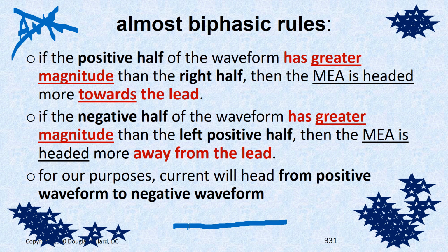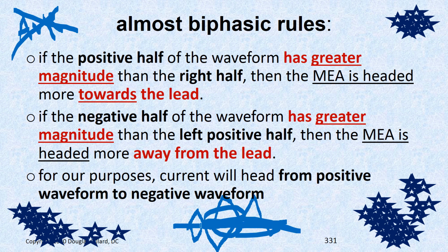Like you read left to right, we're going to always assume the current's flowing left to right for right now. Whether it be a little one or a great big one, it's always going to be to the left. AVR is reversed. It'll be down, and then the trailing wave will be up. But don't worry about that. It'll mess you up. All right?